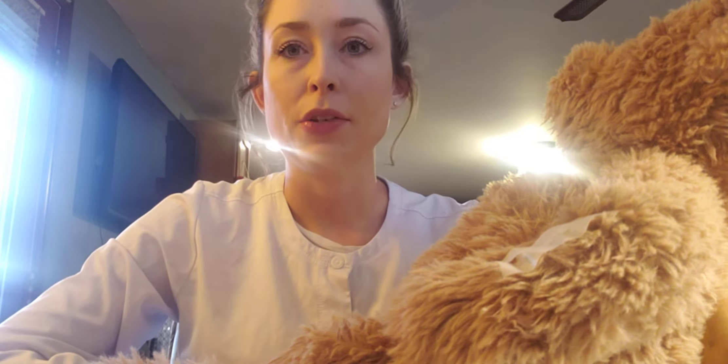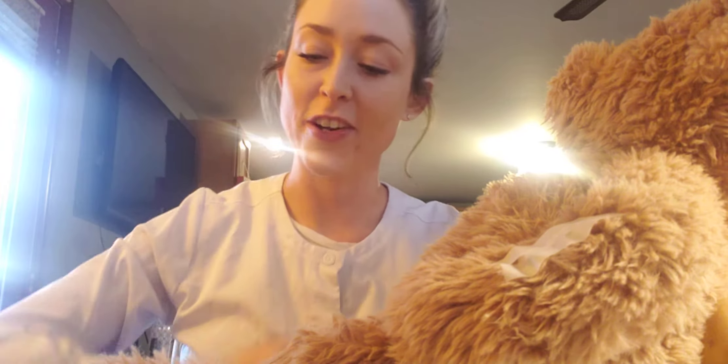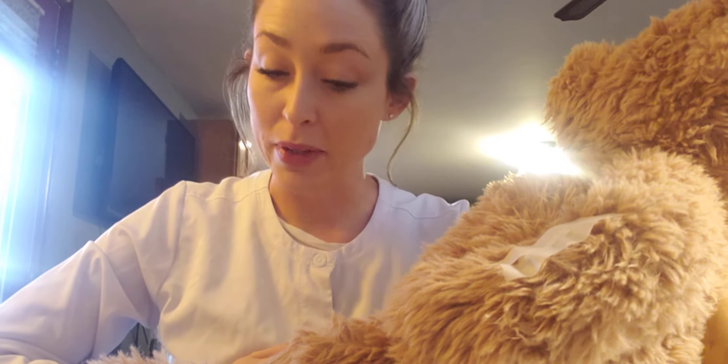Hello. For this video I'll be talking about IV site assessment as well as fluid assessment. I'm hoping to demonstrate this on Mr. Bear here, so I'm hoping that this fake IV site that I've concocted is enough to get the job done. First and foremost, we're checking the IV site for complications.